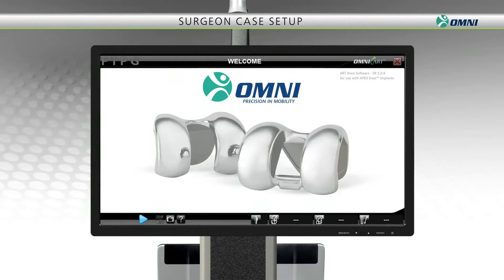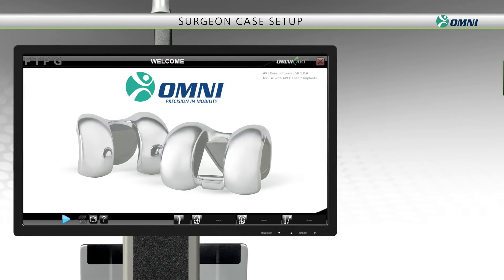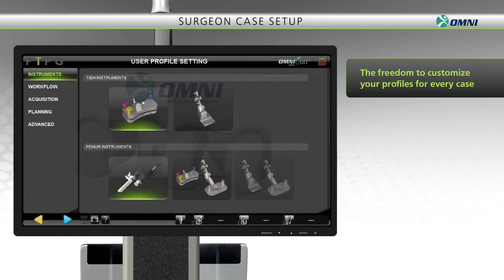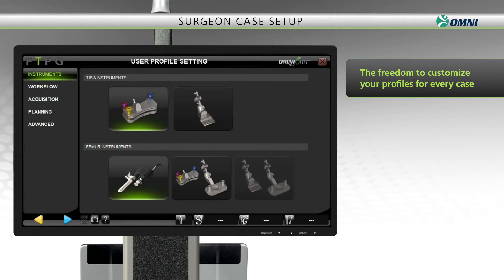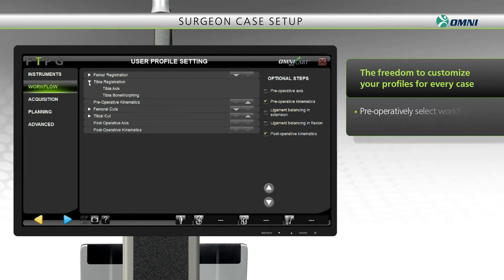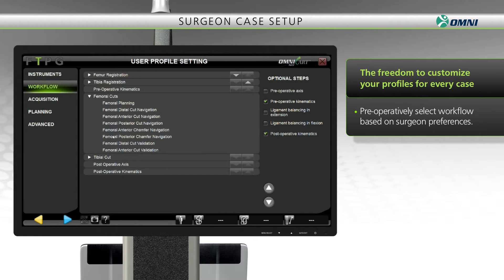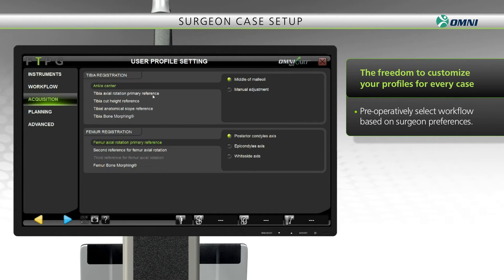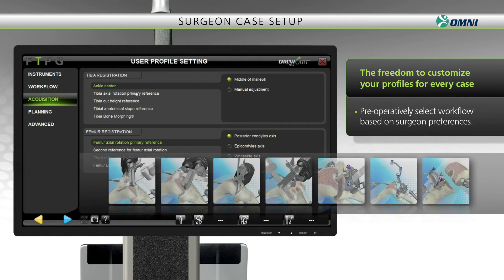The Omni system has been designed to accommodate a near limitless combination of surgical techniques. Whether you prefer to cut the femur or tibia first, follow a measured resection philosophy, and or maintain ligament balance, the system gives you the freedom to customize your profiles for every case. Your workflow can also be adapted intraoperatively. In this short demonstration, we'll showcase a robotically assisted femur first approach.